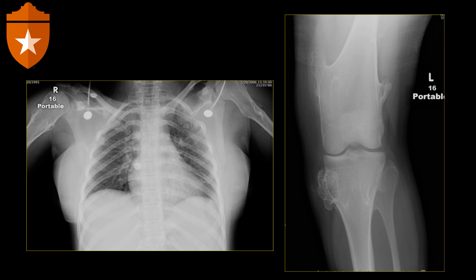Here we have another case: AP views of the chest and AP view of the left knee. We see multiple lesions in almost all visualized bones — at the distal femoral metaphysis, proximal tibial metaphysis, proximal fibular diaphysis, and bilateral proximal humeri. These lesions have continuation with the medullary cavity and some point away from the articulation. This is a classic example of osteochondroma that happens to be multiple throughout the body, a condition called multiple hereditary osteochondromatosis or exostosis. The lesions are far away from the subchondral bone and the articulation itself looks normal, so this is a bone process and not an articular process.